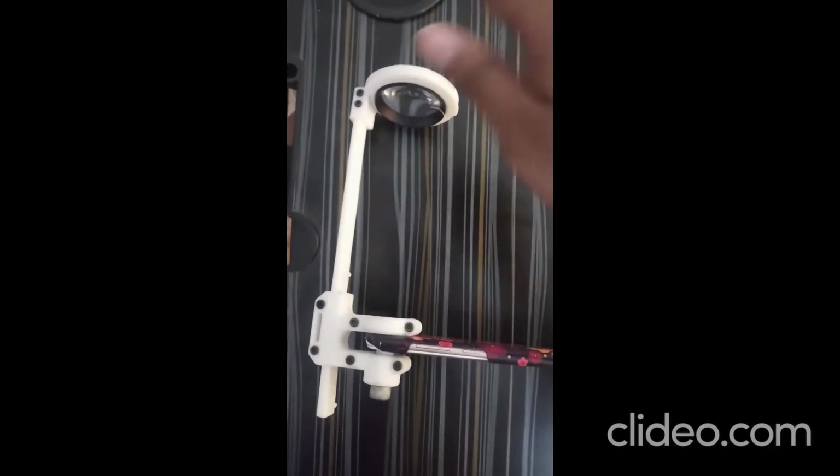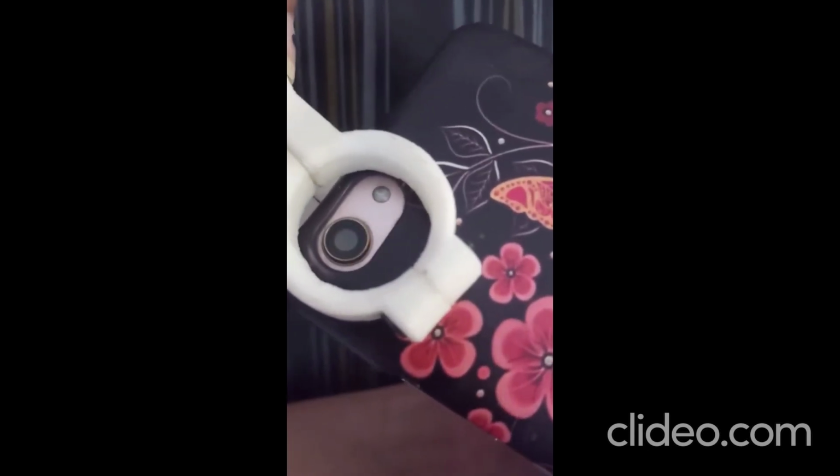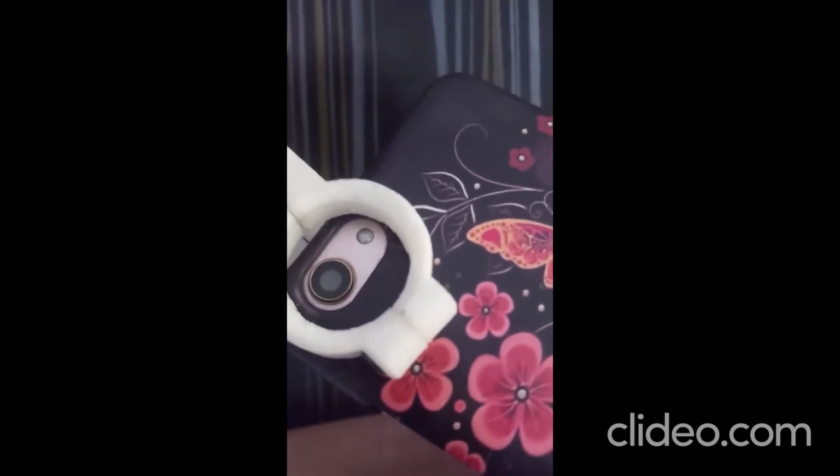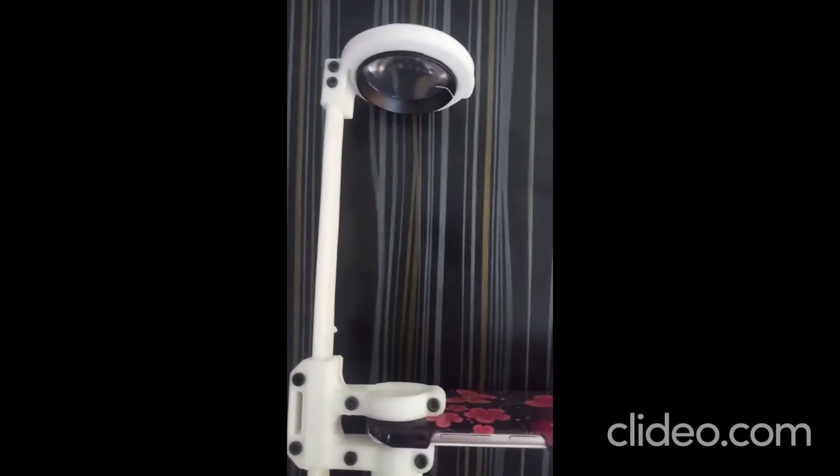In the ODOX equipment, this is a lens holder and this is a phone holder. Here we placed a lens, and we placed the mobile phone in the holder such that the phone flash and the camera are concentrated in the same area.